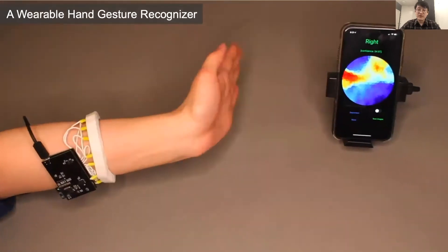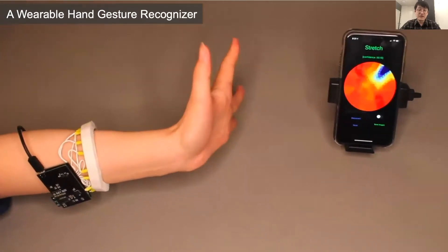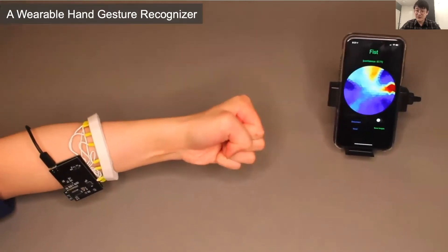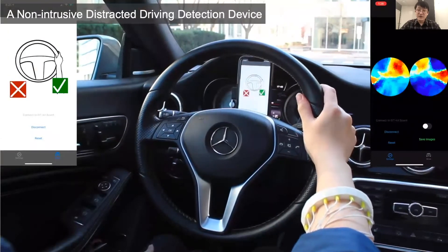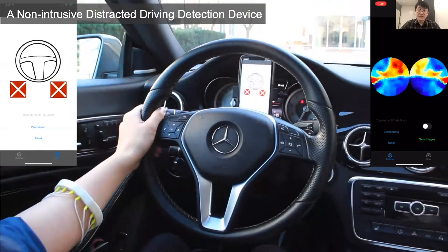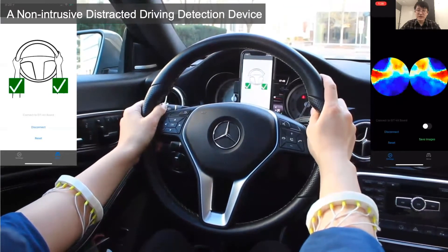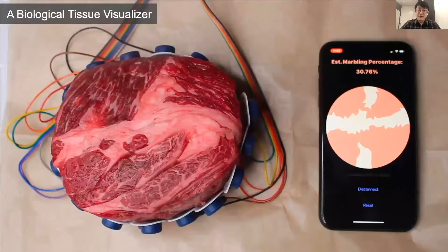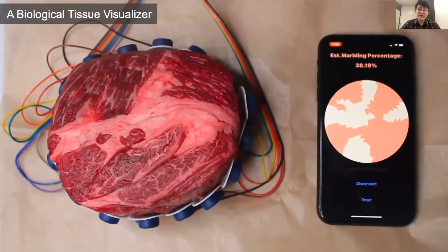We also built a wearable hand gesture recognizer. This application demonstrates that EIT Kit can help users quickly prototype EIT devices for classic EIT applications such as gesture recognition, which is one of the main benefits of a toolkit. Next is a non-intrusive distracted driving detection device. This EIT device can identify which hand of the user is on the steering wheel while driving, and can also monitor driving habits and remind users to switch hands to avoid pain on long drives if one hand is overused. Finally, to demonstrate EIT Kit's capability of sensing biological tissues, we built a biological tissue visualizer where a cross-cut piece of meat is used to closely emulate human tissue.